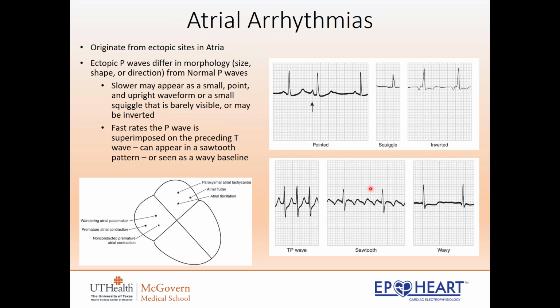And then the sawtooth, this should be pretty familiar to everyone. This is your typical flutter, you have that sawtooth pattern. And then this one is atrial fibrillation. You have no discernible P waves. It's just kind of irregular, erratic atrial activity.